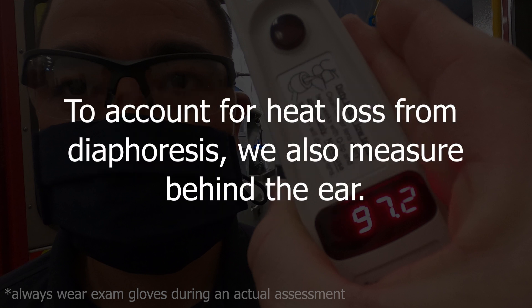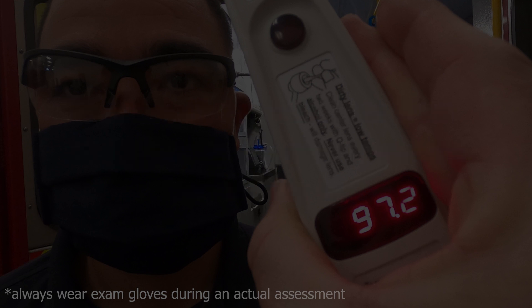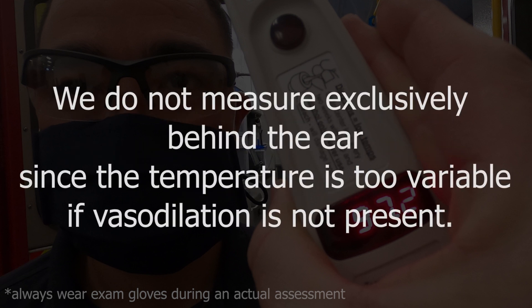To account for the heat loss on the forehead, we also measure behind the ear. That being said, we do not measure exclusively behind the ear because the temperature is too variable when vasodilation is not present.